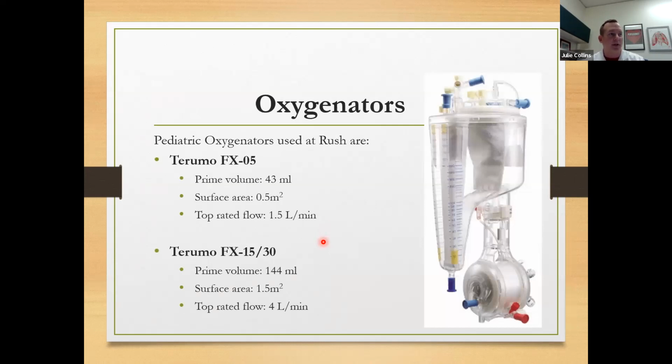Talked about the oxygenators. Here's our Terumo FX oxygenator. The FX series has the integral filter, so it's an oxygenator and it's a filter. Static prime volume of this is 43 mils. So it's 43 mils to fill this tiny oxygenator.